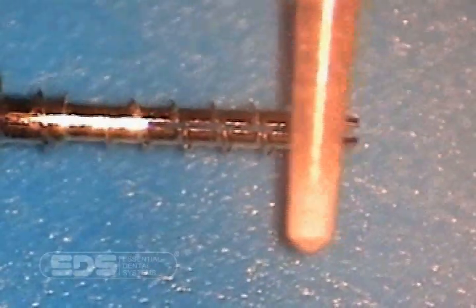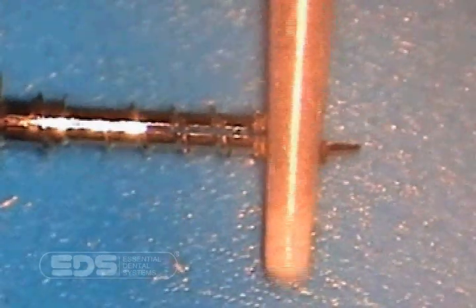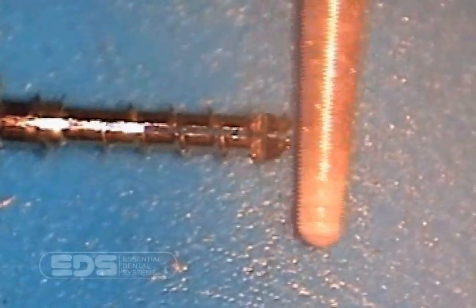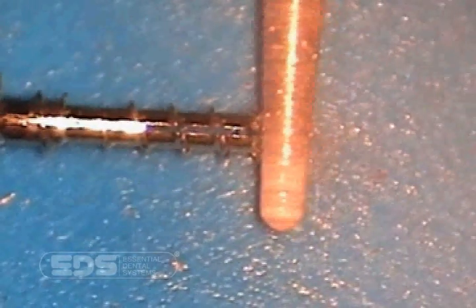Remove the post and then you may cut from the apical end of the post. Each thread line is approximately 1 millimeter apart. Therefore, you may remove 1, 2, 3, or even 4 millimeters of apical length of post without reducing the retention. We do not have to reshape the conical end.